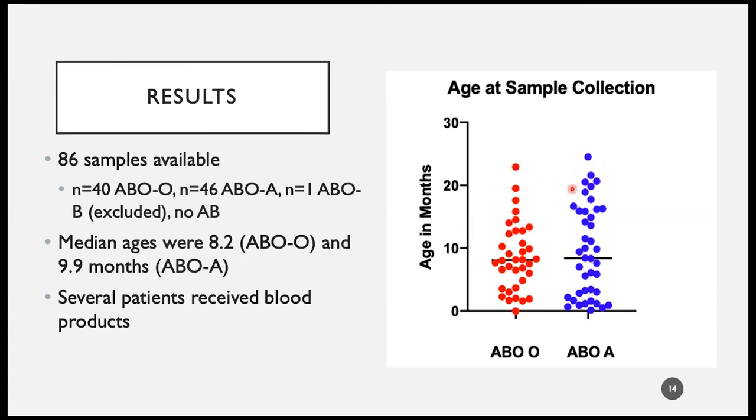Several of our patients did receive blood products or transfusions, which is a limitation in our study since it may have affected both our Luminex and hemagglutination results, but we're still collecting this data from our patients and from the transfusion records, so it is not yet being considered in the figures I'm about to show you.